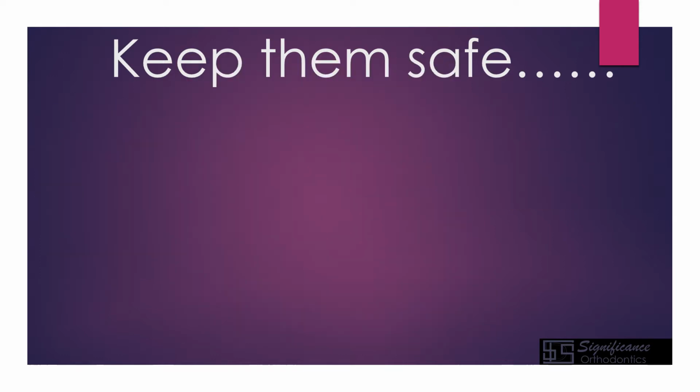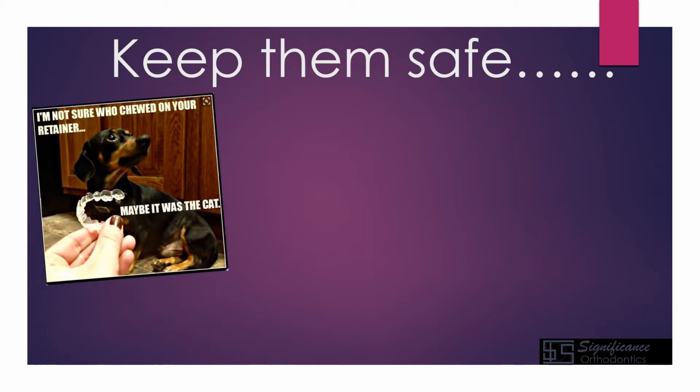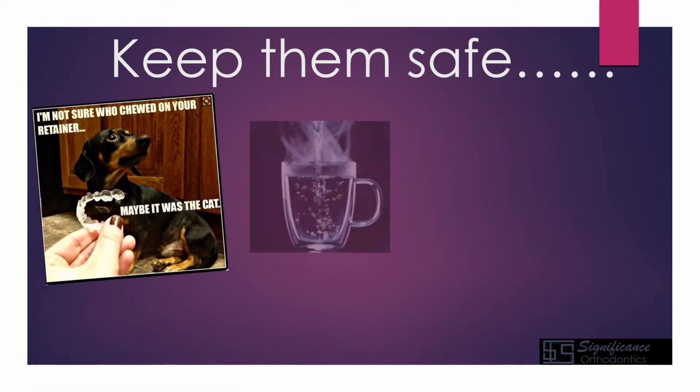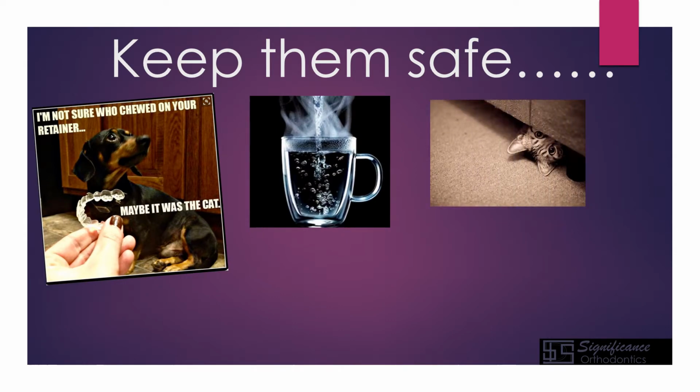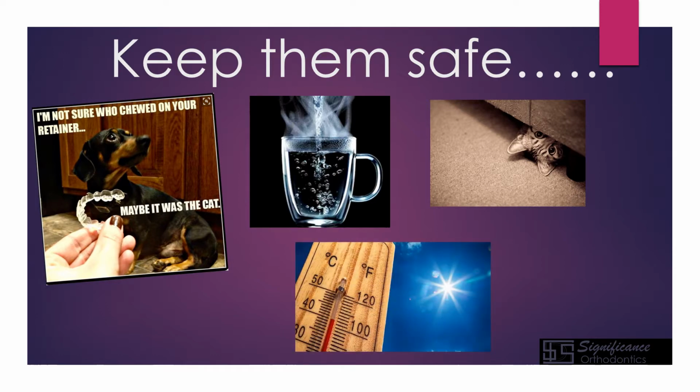So to review, as far as keeping them safe. Remember, you're going to keep them away from dogs. You're not going to sterilize them in hot water. You're going to keep them away from cats. They'll end up under the couch, under the bed. You never know where a cat's going to hide your retainers. And also keep in mind, those of you that play sports, or you're running in really fast, so you leave them in the car. That hot Las Vegas sun does not play nice with retainers. They will distort them, okay?